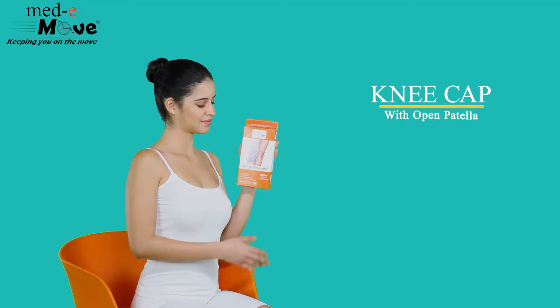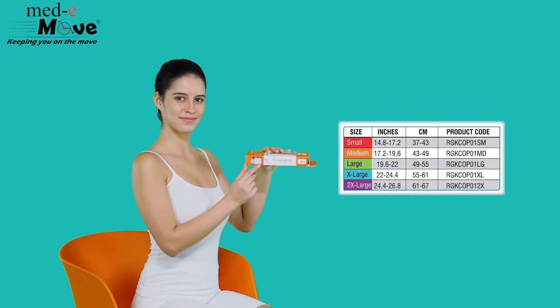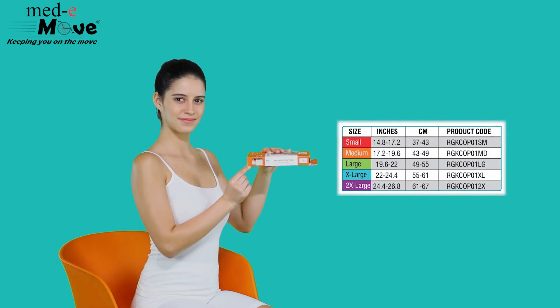Here we will demonstrate how to measure the size and wear the Medimove kneecap with open patella. The kneecap with open patella is available in 5 sizes.